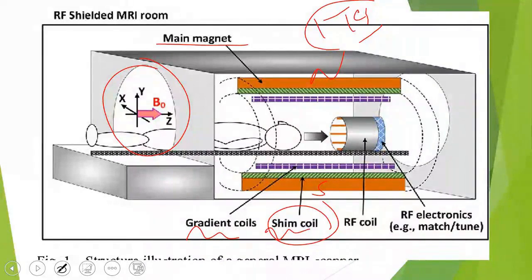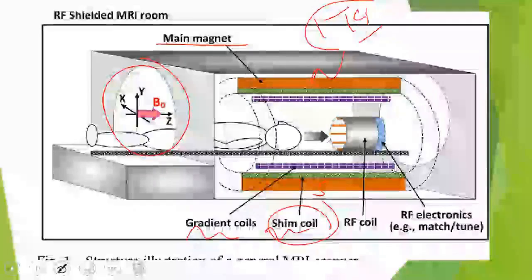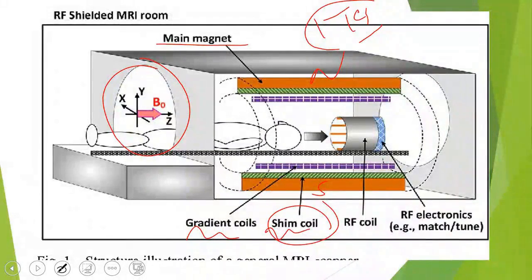As we discussed yesterday, you use these 3 for taking your image. In simple terms, first I have 3 axes present. What are the 3? The Y, and X and Z. The Z is the one that corresponds with the patient. The Y is perpendicular to the patient. The X means you are moving from left to right. The Y-axis is vertical from top to bottom. The Z-axis moves as if you are moving through the patient's body until you reach the head. In the third direction, I can adjust my gradients, which change the main magnetic field.